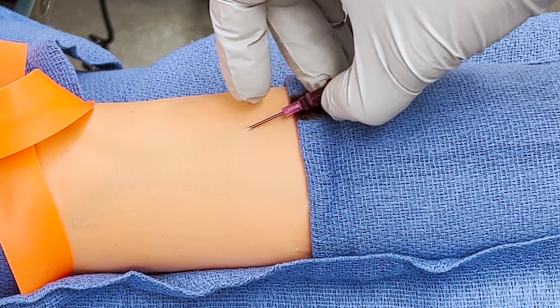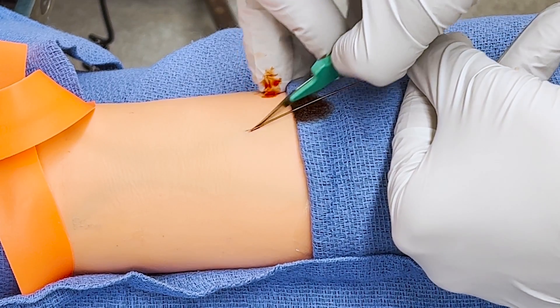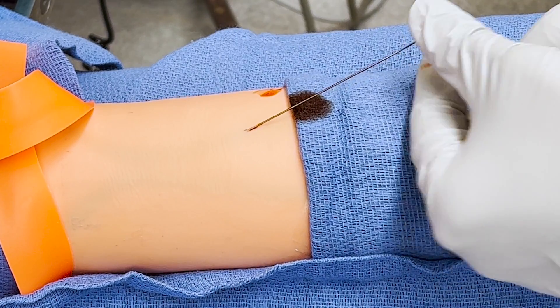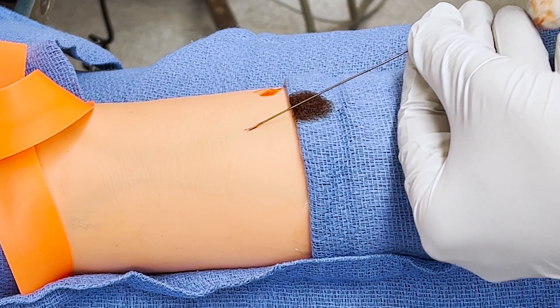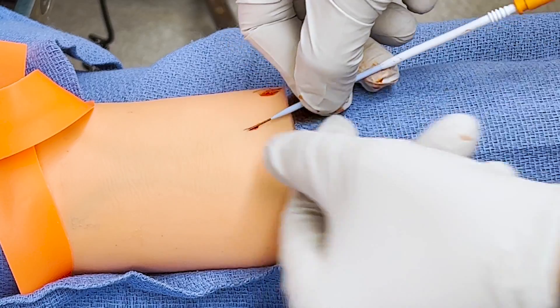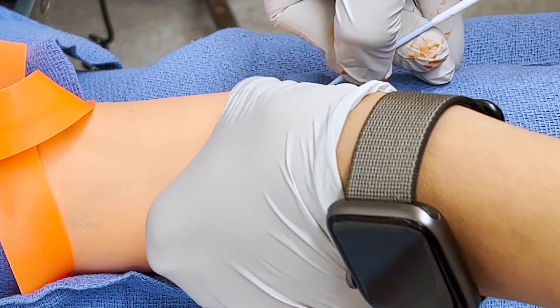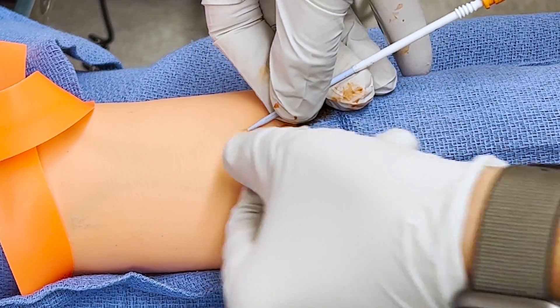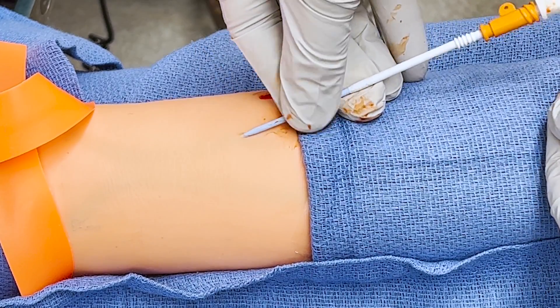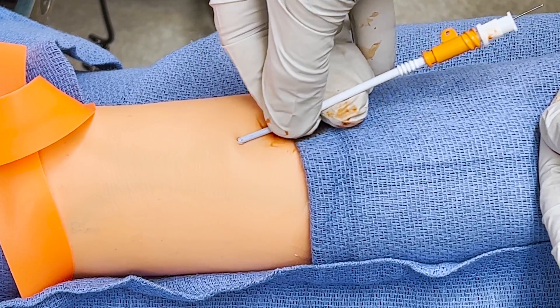Remove the 20-gauge catheter. With the scalpel, make a small, superficial, 2–3 mm skin nick along the wire. Feed the combined catheter and dilator over the wire, ensuring that the wire exits the catheter hub at the top. Pull the skin taut and insert the dilator into the skin and advance until the catheter is cleanly in the vessel.